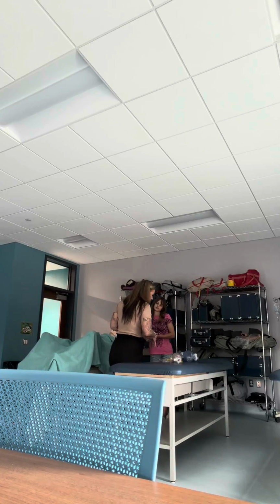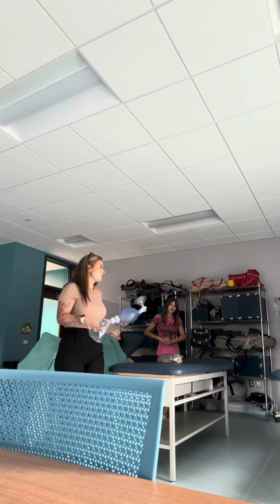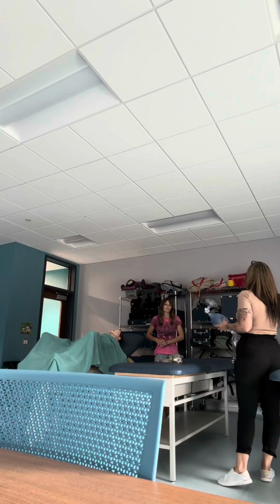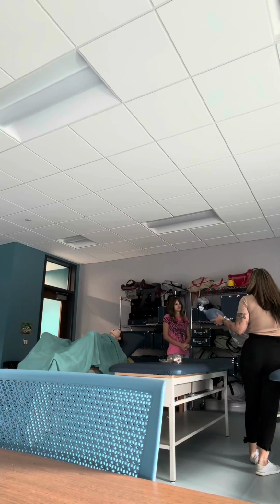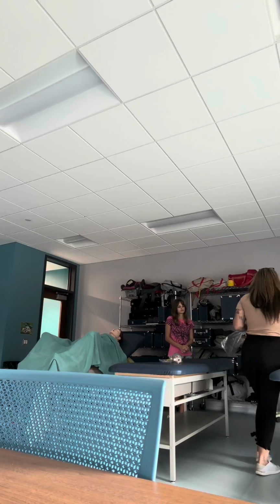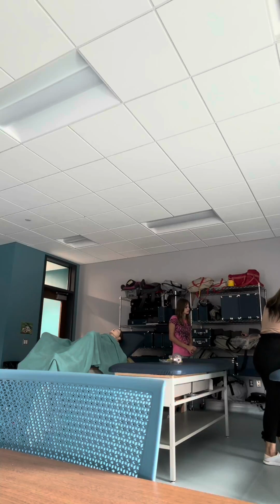So with pediatrics, the respiratory rate is naturally higher than adults, right? So whenever we're ventilating a pediatric patient, instead of going every 6 seconds, we're gonna go every 2 to 3 seconds, okay? So same exact situation where we're gonna cover the nose and the mouth, and we're gonna create our C-clamp seal, and we're going to ventilate.